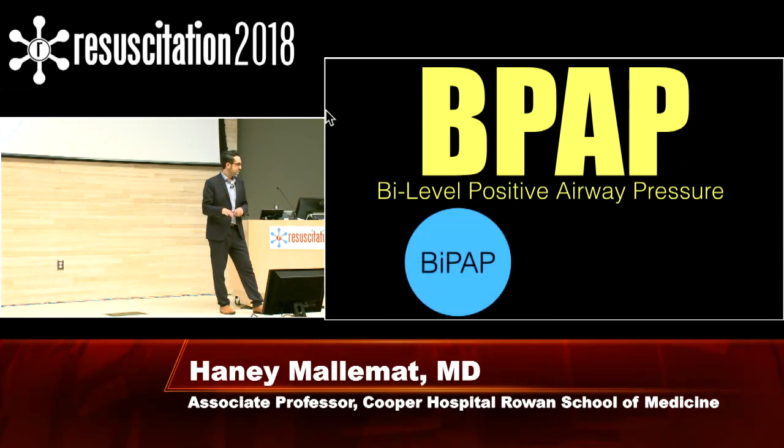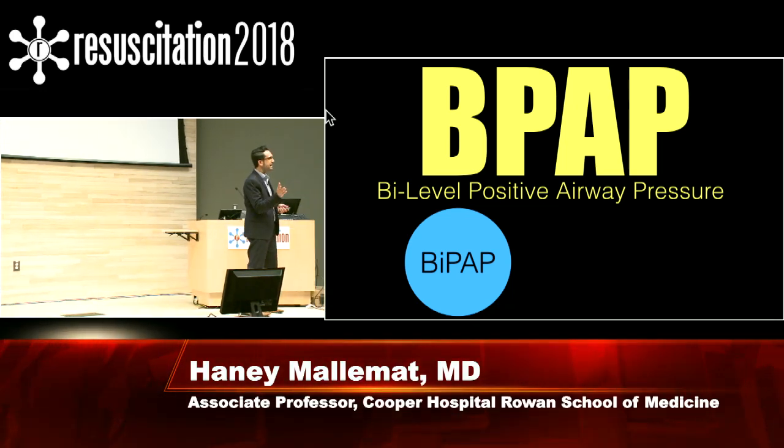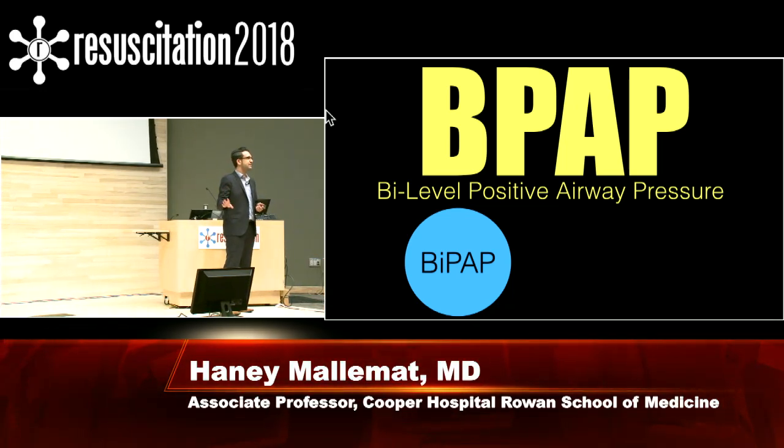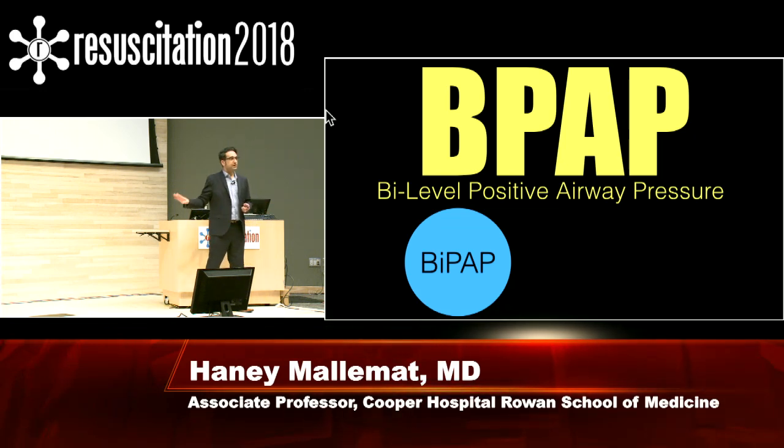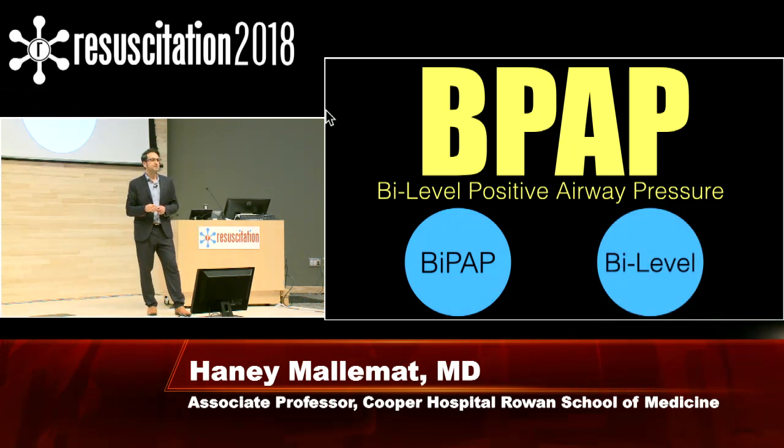Just so you know, BiPAP is actually a trade name. And we say it all the time, get the BiPAP machine, but it's technically like saying Tylenol. Okay, I don't know, CME conference, oops. But BiPAP is a trade name. So if you really want to be academic, say bilevel ventilation, but I don't think anyone's going to call you out about saying BiPAP.